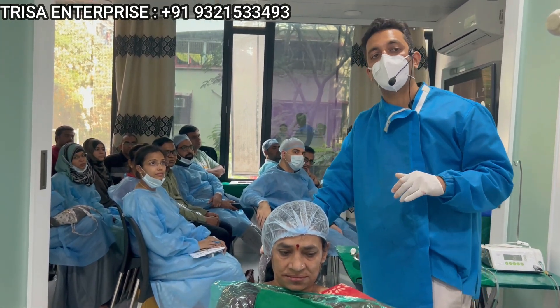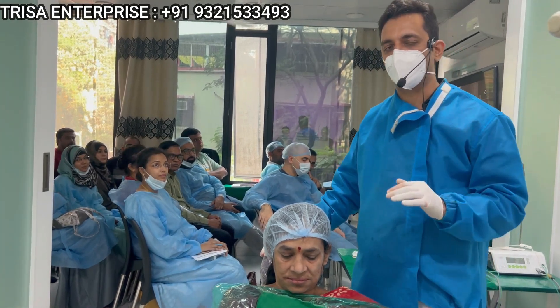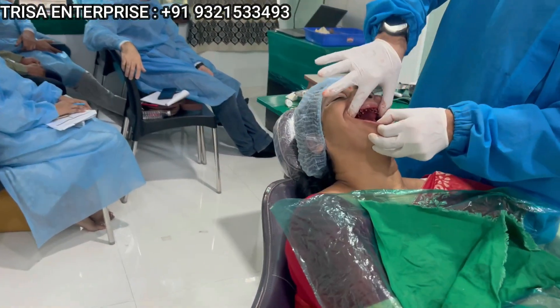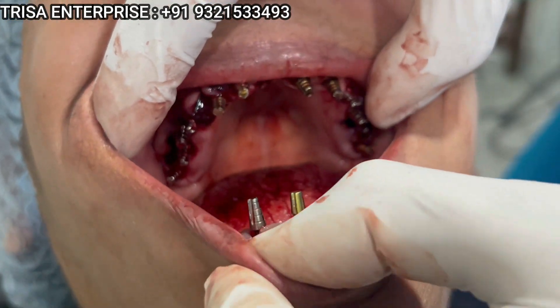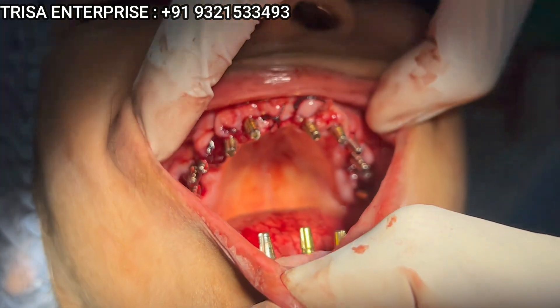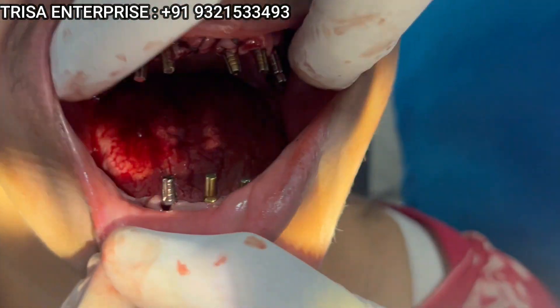First, before I go ahead to show you how to take the accurate jaw relation, I want to show you all the implants. Just have a look at all the implants which are placed. Upper and lower jaw — complete flapless implants have been placed.